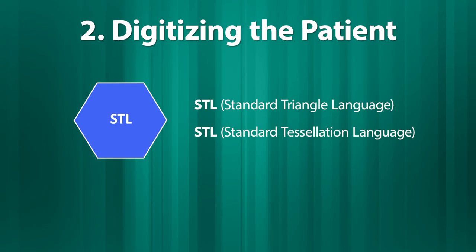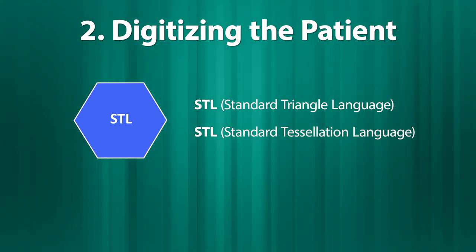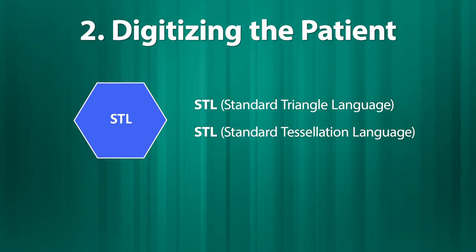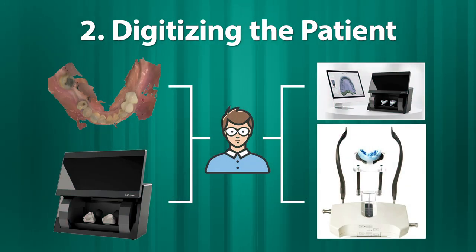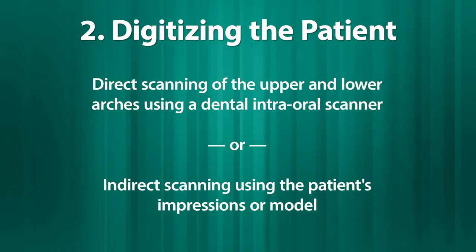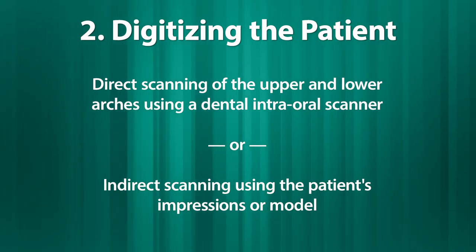The second step in the workflow is digitizing the patients to obtain an STL file, which stands for Standard Triangle Language or Standard Tessellation Language. Digitizing the patients involves direct scanning of the upper and lower dental arch using an intraoral scanner, or indirect scanning of the patient study models or the patient's impression using a desktop scanner.